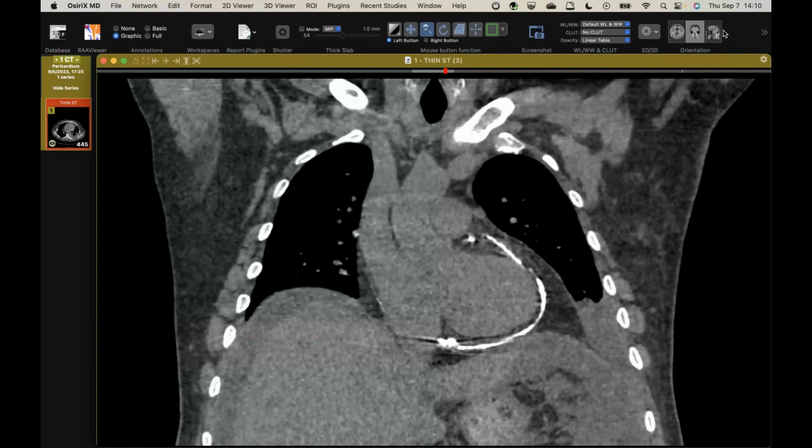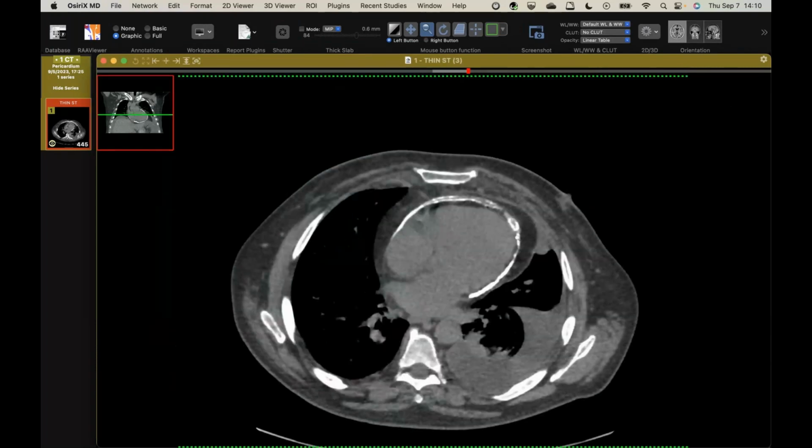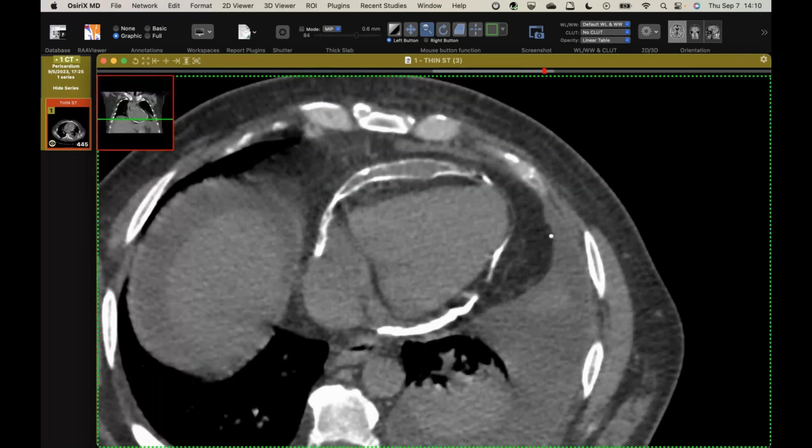Whereas calcification from a calcified infarct, its favorite location is the apex. And your case seems to meet those criteria. It spares the apex of the LV.